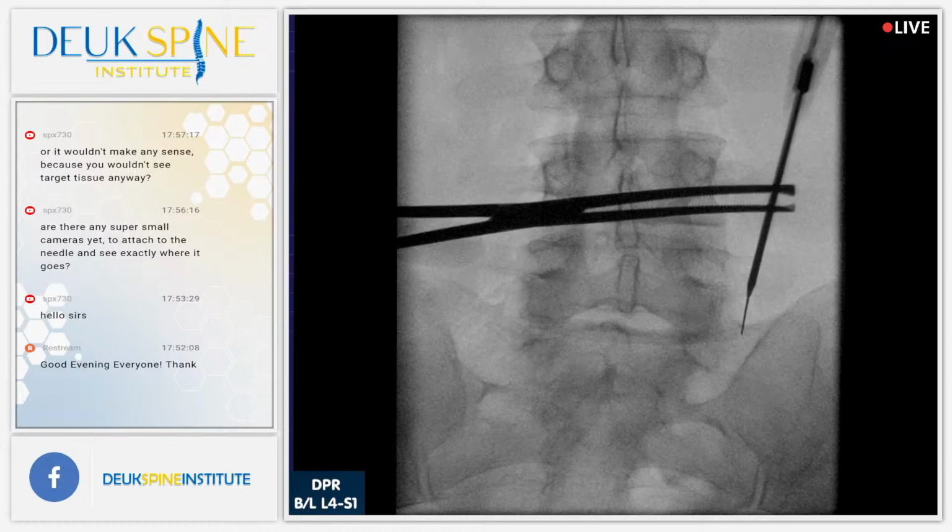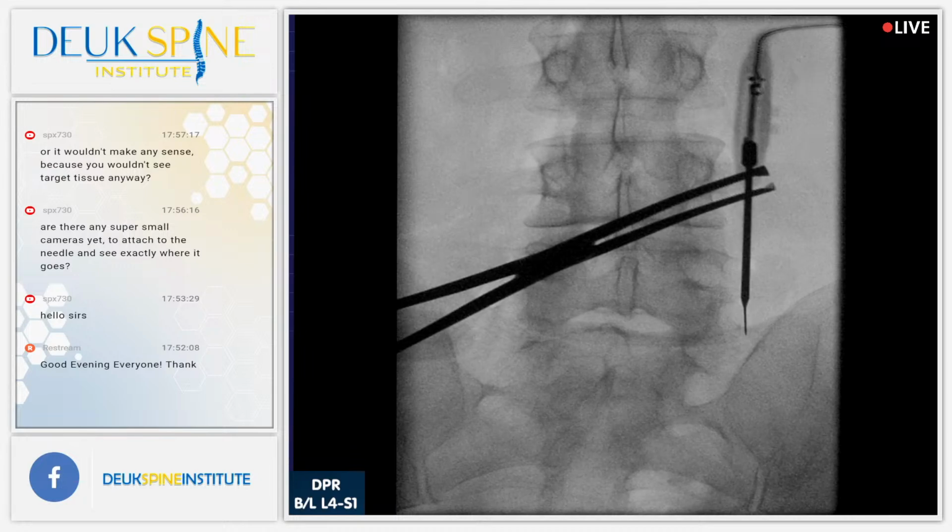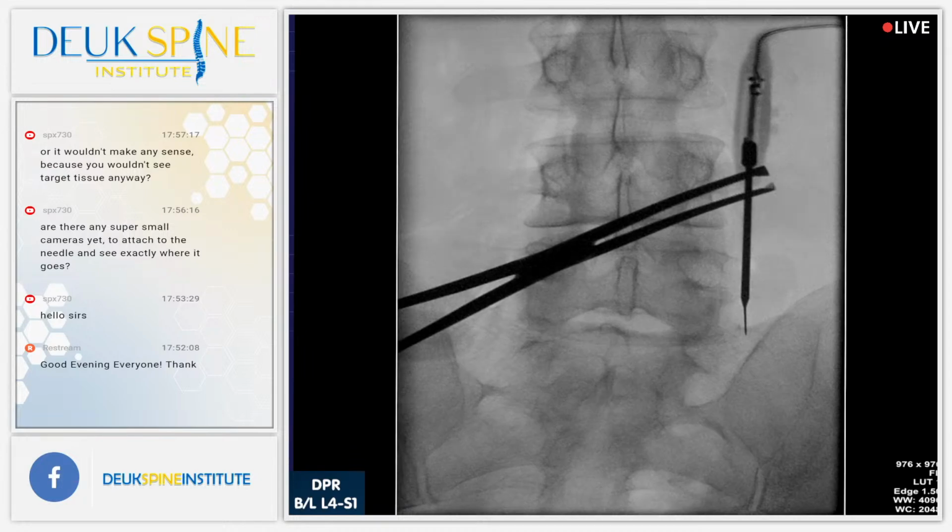Shot. All right, so just about there, you guys can see that little valley. Shot. Right where the tip of the bipolar is, the bovie is, you can see the valley. I just can't feel it yet. There it is. I feel it now. And sometimes you have to push down. The reason why you have to push down is that there's fascia. There's a fibrous membrane above the spine that is catching my tool and pushing me backwards. So you got to fight it a little bit.